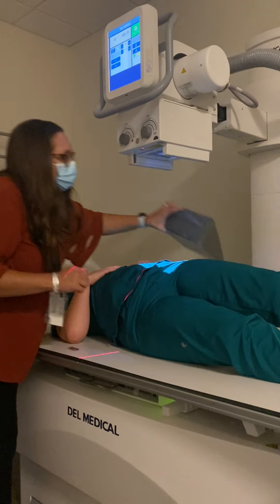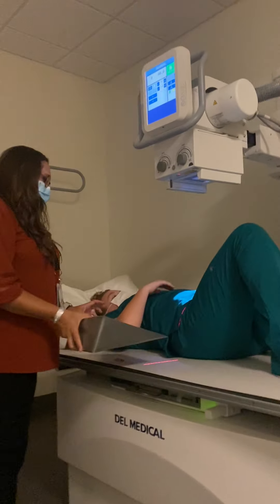I would have my patient hold their breath. They can breathe, and then I'm going to do the other side — go ahead and roll up, I'm going to take that out and do the same thing on the other side.